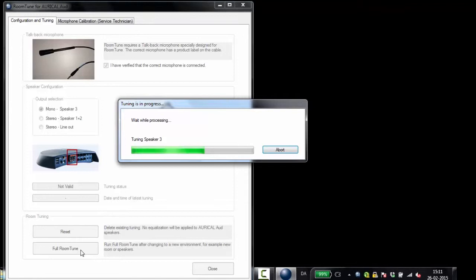Once the initial Roomtune measurement is finished, please remember to make any calibration or adjustments which might be required by your fitting modules. You are now ready to use Roomtune with your fitting modules.